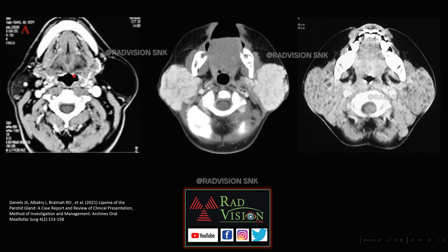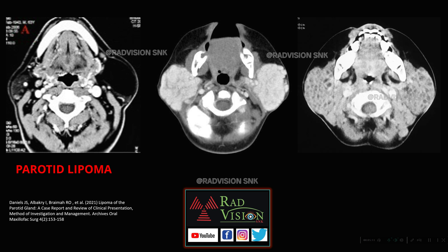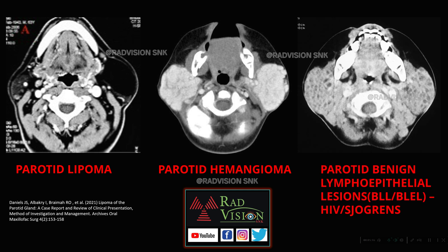Next are three parotid lesions. The first is a fat-containing lesion completely replacing the left parotid gland and partly the right — a parotid lipoma. In infants, both parotid glands may be bilaterally enlarged and replaced by hyperdense tissue — parotid hemangiomas. Sometimes both parotid glands are enlarged with multiple tiny cystic lesions scattered throughout — lymphoepithelial cysts. These are the top differentials for parotid lesions: lipoma, hemangioma, and benign lymphoepithelial lesions (BLL).